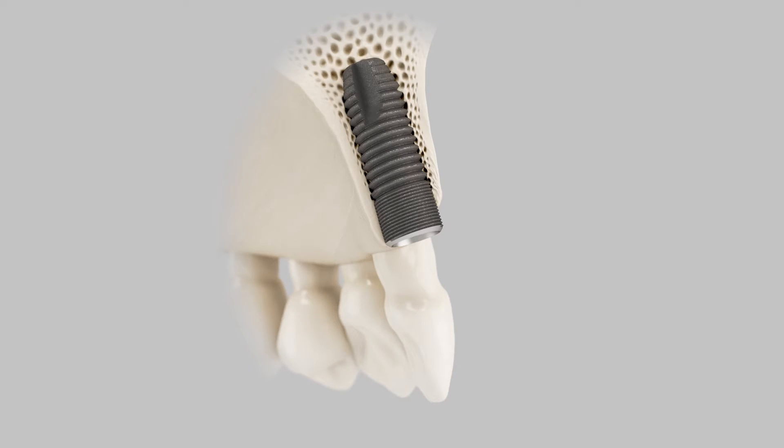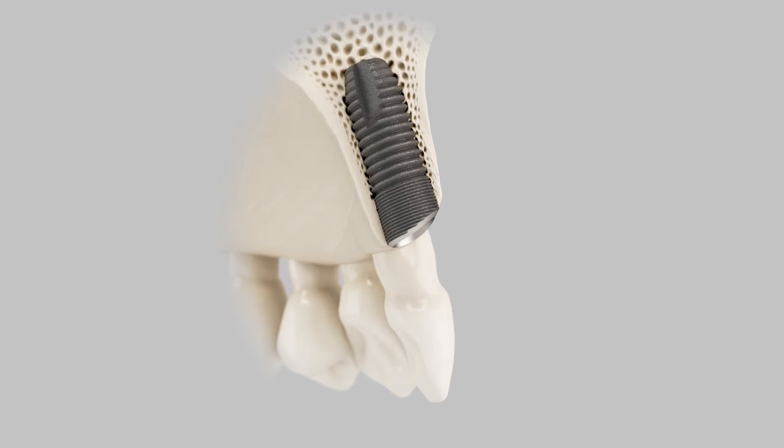The profile implant encourages you to place the implant in the more correct axial position. It is unnatural when you have an implant with a flat top to put it in a sloping topography. In fact, it is much easier to line up a profile fixture with a presenting anatomy than it is to take sloping anatomy and try and figure out where to put a flat top implant.